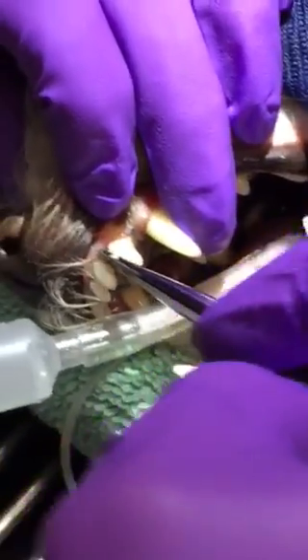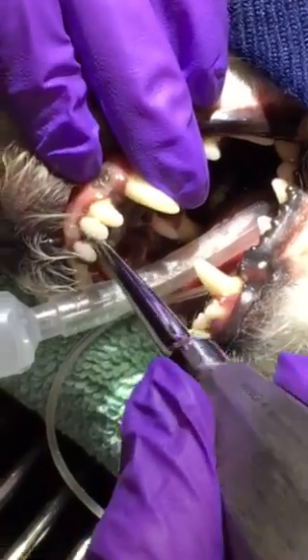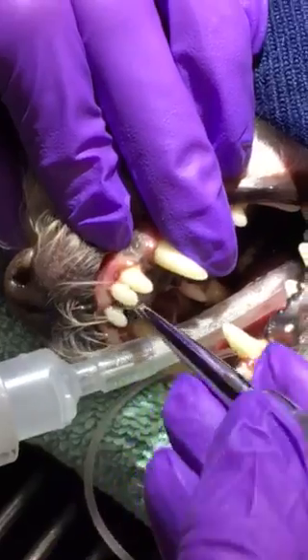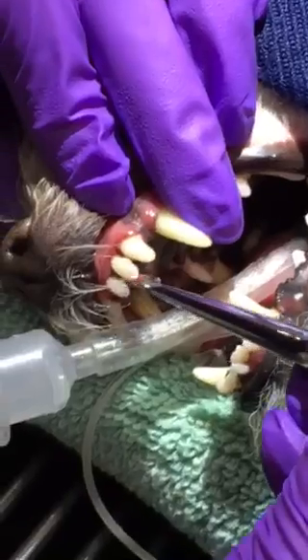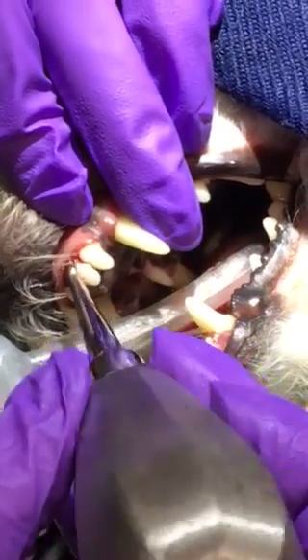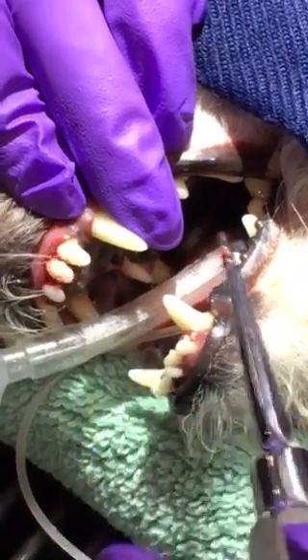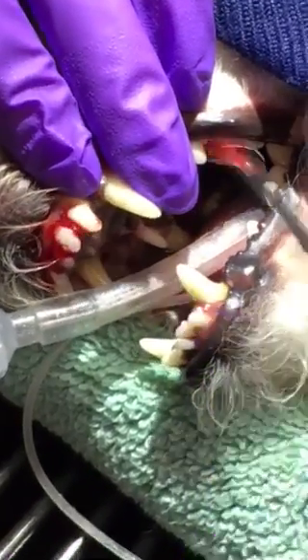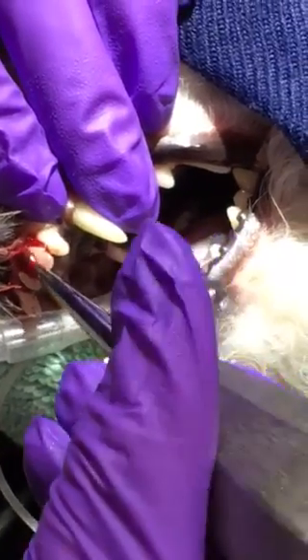We do this very gently — if you're a little squeamish, just know that there's going to be some blood. We go all the way around the tooth 360 degrees in all directions, very loosely. You can see a lot of mobility here in Mim's tooth already, as her tooth was pretty loose to start with. We go all the way around, and there's lots of blood so we just clean it off as we go.